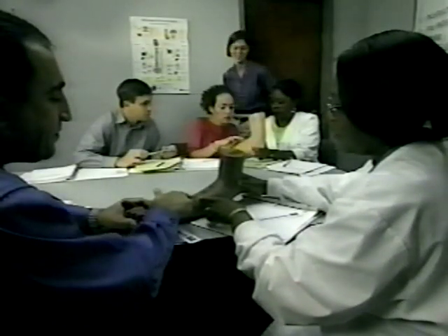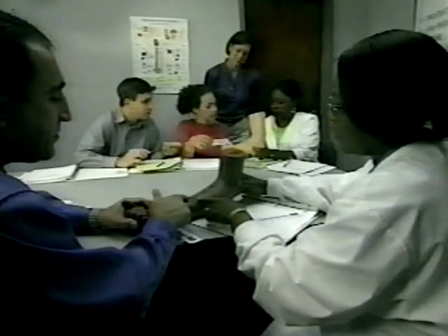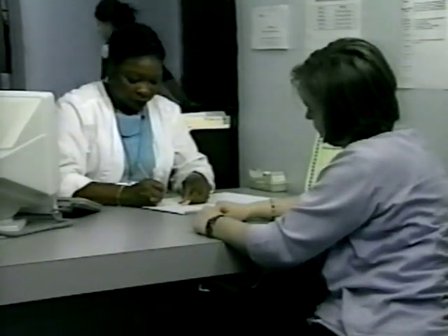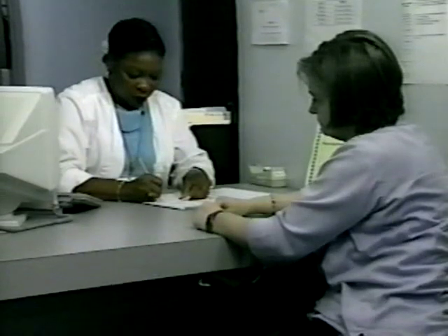A great deal of practice is required to achieve consistently reliable measurements. The skin test should be read between 48 and 72 hours after it has been administered. A patient who doesn't return within 72 hours will probably need to be rescheduled for another skin test.